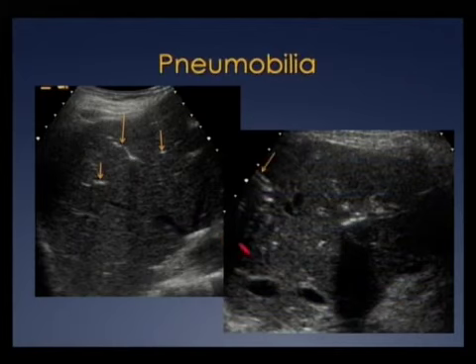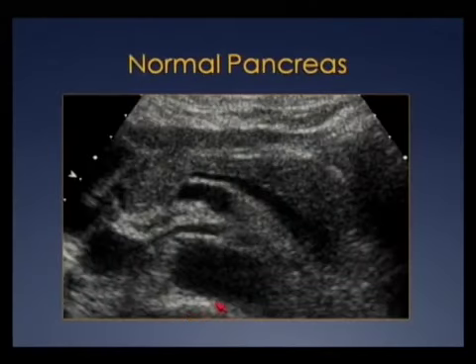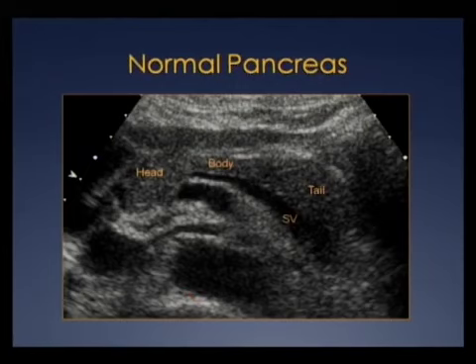And again, when the patient's position changed, the appearance of the echogenic foci also changed. This patient had had prior biliary intervention. Even though Dr. Voci went over the normal pancreas, I just want to illustrate again the importance of knowing your midline anatomy. We frequently see abnormalities in the midline without necessarily seeing the pancreas. We want to make sure where these abnormalities are.